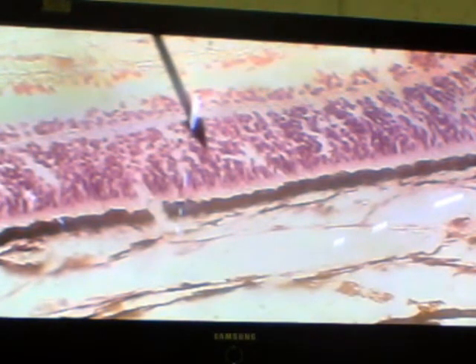We need to get some horizontal messages going across so that we can all flow together, because if you notice, the outer nuclear layer is very dense, but the inner nuclear layer is not so dense. Neither, and look at the most internal layers. The number of nuclei down here, in this layer, is comparatively low.